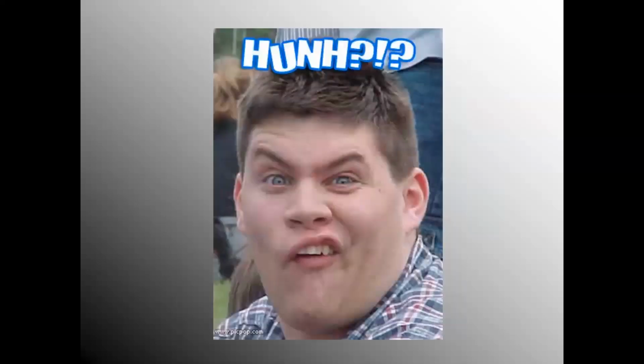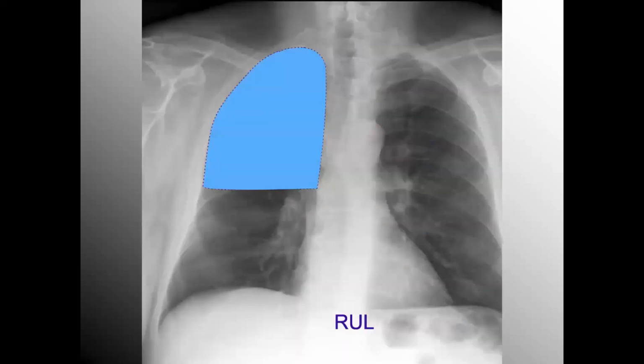I know we kind of have this thought every once in a while when you pull up an x-ray and you didn't expect what you get. So with the right upper lobe, I know it's a very simple picture here, probably self-explanatory, but I want you to be able to appreciate, because we get kind of in this rut of looking at just an anterior view each time, and we forget that there is a certain depth of occupation of a particular surface area of a lobe of the lung, such as the right upper lobe.